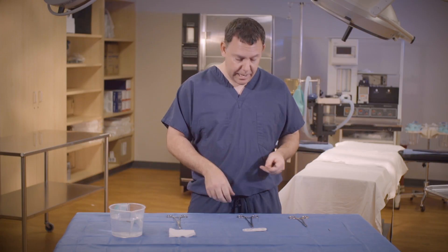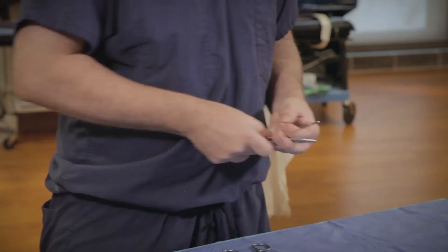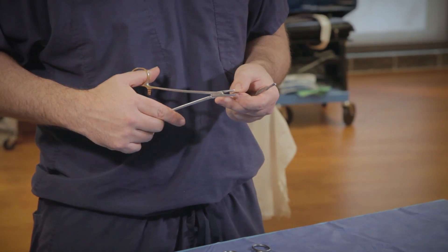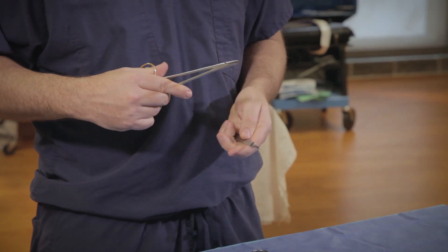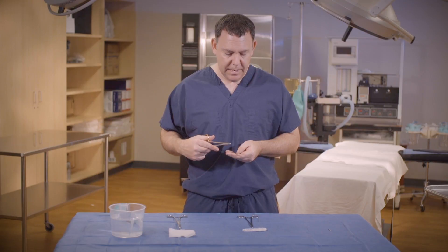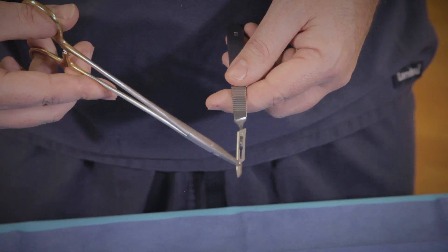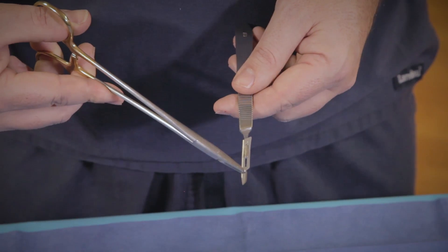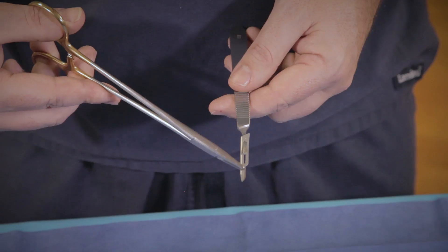So using your right hand, take the needle holder and grasp the blade at the top with the sharp side facing to the left. With your left hand, position the knife blade so that it's angled up and that the angle matches the angle. Carefully fit the blade into the groove and extend or slide the blade down following the ridge of the needle holder until you hear a click.